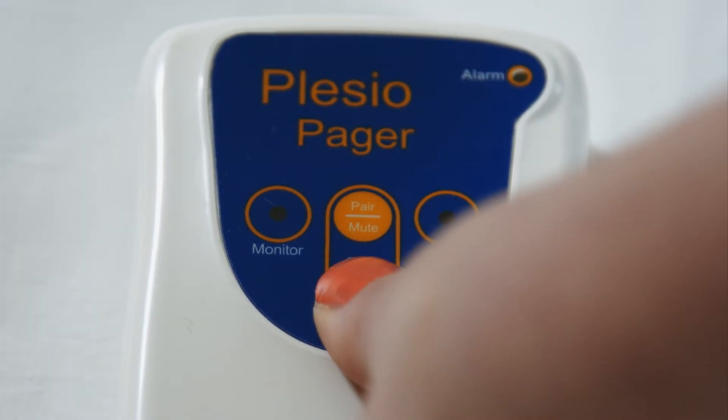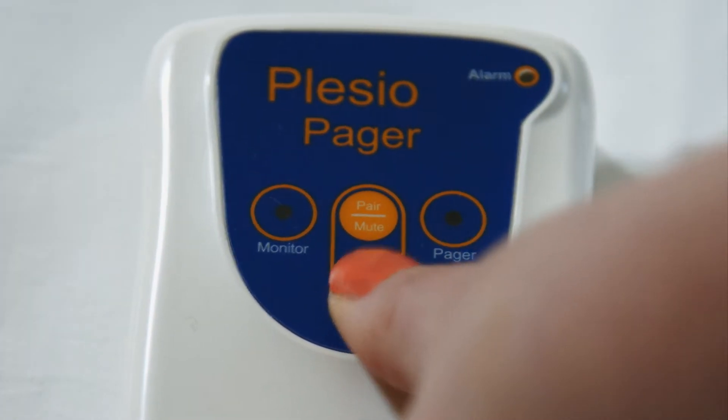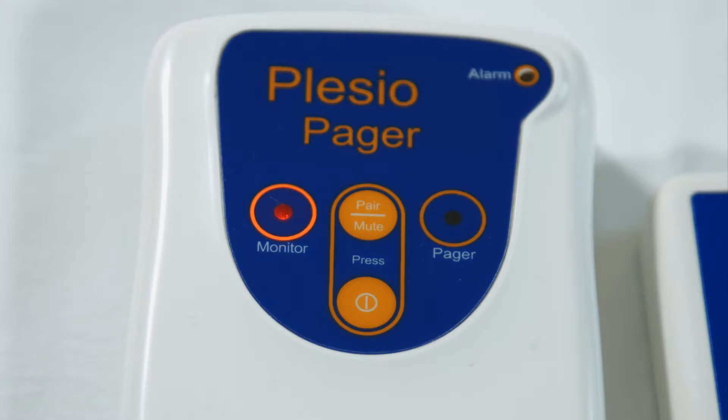Begin by taking the Pager and holding the on-off button for three seconds to wake up your device. The Pager should beep and all LEDs will flash. When awake and listening for alarm signals, the green Pager LED will flash every eight seconds, and the red LED will flash showing the monitor is also turned on.